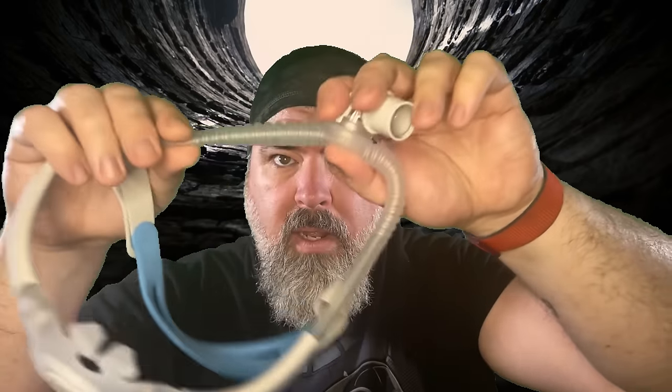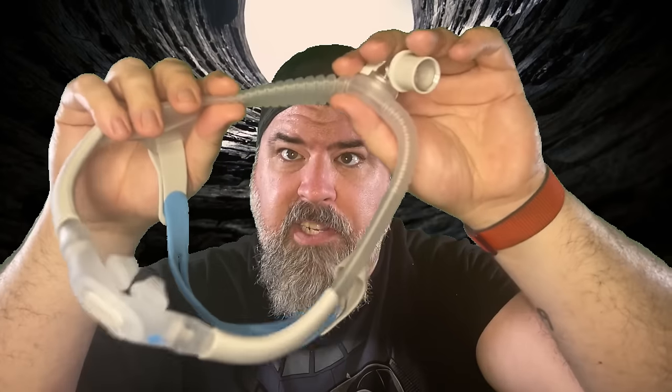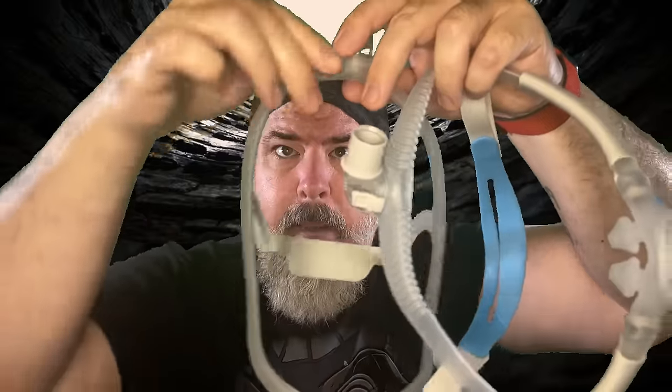One thing I really, really like about the ResMed is that it has this accordion at the top. So with the Philips masks, I'm sort of a weird in-betweener. I was originally prescribed a medium frame. That proved to be too small for me. But the large is what I'm using now is just a little too big for me. So I guess I need a medium large. I don't know. They don't make that. They make small, medium, and large. Medium's too small. Large is too big.